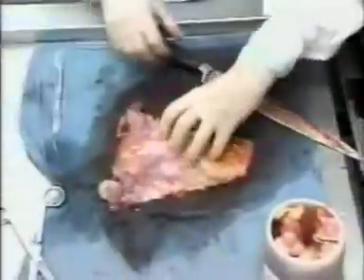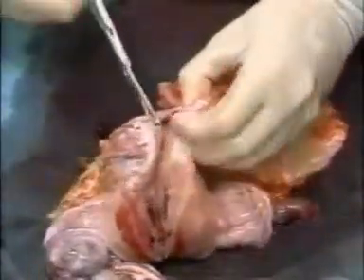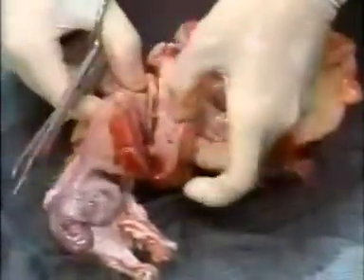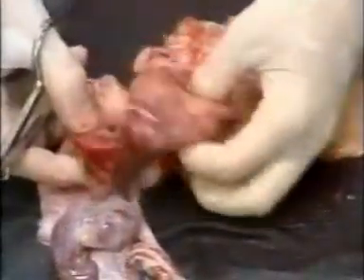The uterus is normal shape and size. And no evidence of tumors in the muscular wall of the uterus. The endometrial cavity appears a little hemorrhagic. Could be an early menstrual phase.